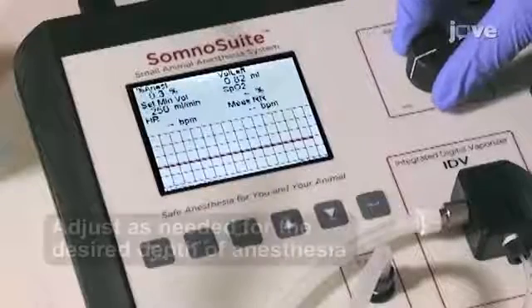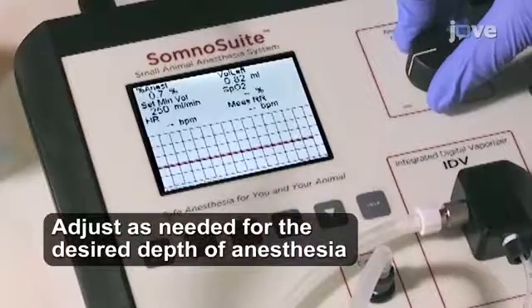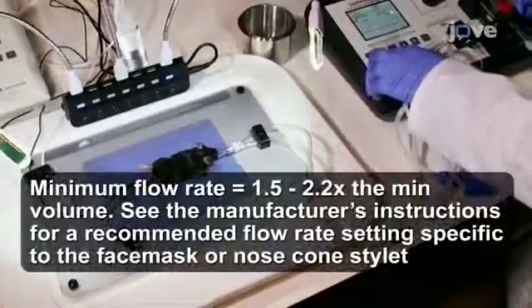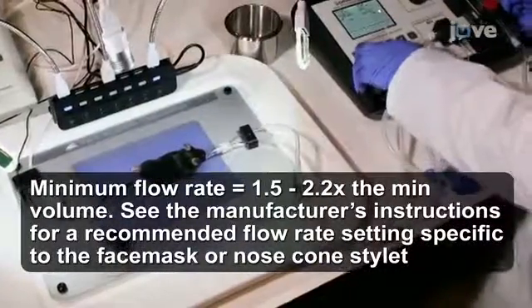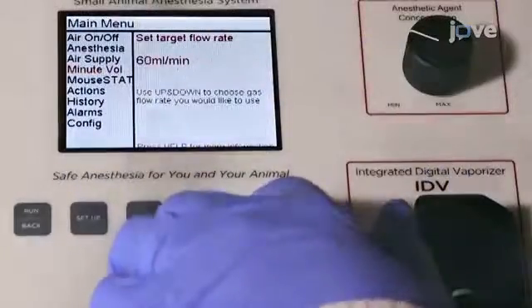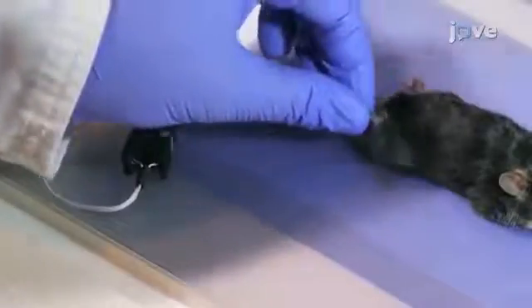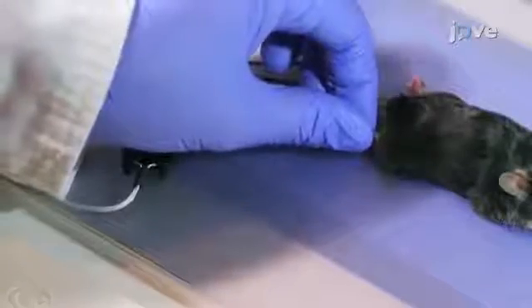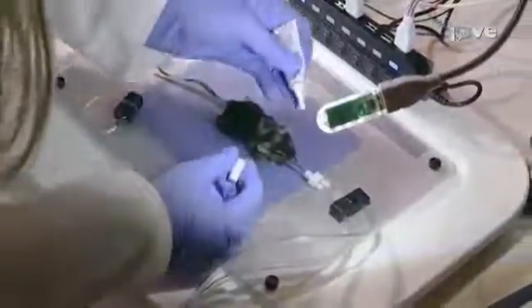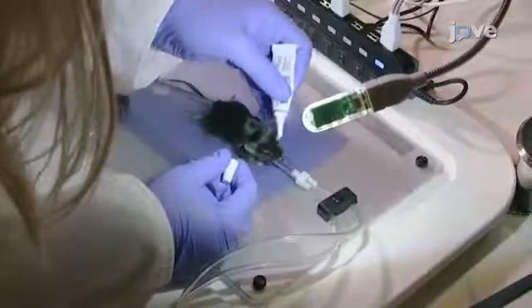With the mouse positioned on the nose cone, adjust the concentration of isoflurane to 1.5%. Now, reduce the minute volume to support anesthetic maintenance. Confirm the depth of anesthesia as determined by a lack of withdrawal reflex during an interdigital pinch. Apply ophthalmic ointment to the eyes to prevent dryness during anesthesia.